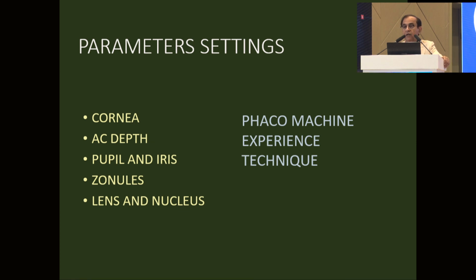It will also depend upon the type of phaco machine you have. With high-end machines, of course, you can keep very high settings. Experience and the technique you are going to use also matter. All these things have to be taken into consideration.